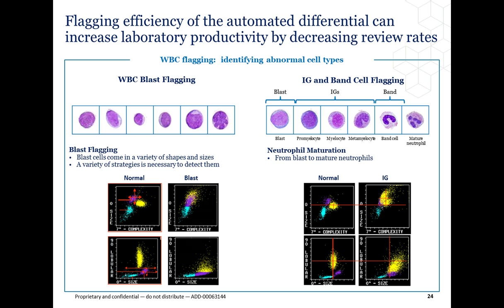However, there's still a great deal of room for improvement. With the improvements in laboratory information systems, though, many rules may be applied to coincide with the automated system's overall flagging efficiency. So we are making progress. Unfortunately, we're not eliminating these altogether.